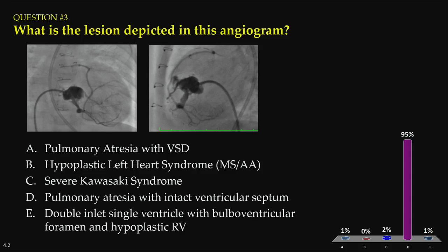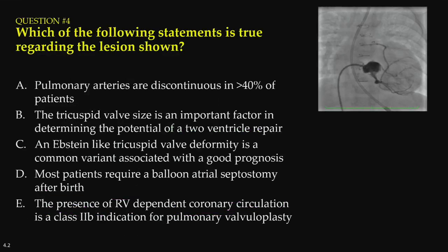Okay, excellent. That one, you guys nailed it. So that's pulmonary atresia with an intact ventricular septum. I would just say, pay attention. Like you read an x-ray, you sort of look at everything. So look at this catheter course. It's coming up the right side. So that's probably the inferior vena cava going to the right atrium. And then it crosses this tiny tricuspid valve into this little chamber that then fills, and you see what look like coronary arteries. So that's a typical classic angiogram of PA-IVS.